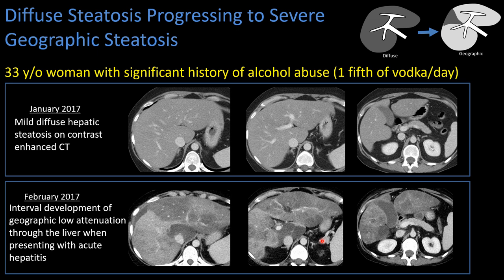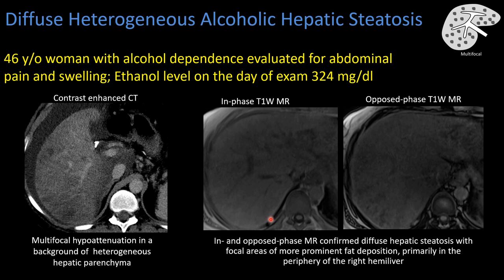When we think about diffuse steatosis, most commonly we think of it as a really homogeneous process, but again we can see a multifocal or heterogeneous appearance. Here on contrast-enhanced CT we see these nodular areas of low attenuation in a background of a heterogeneously low-attenuating liver.